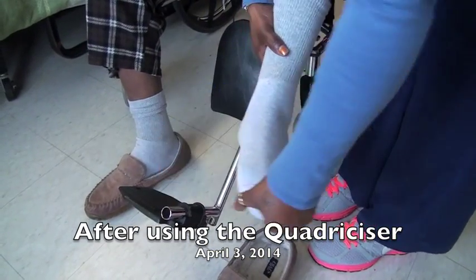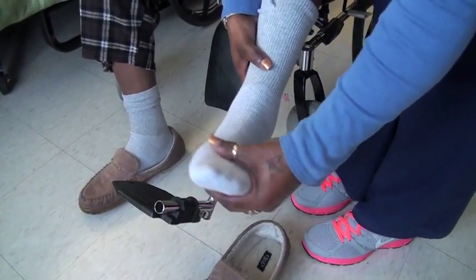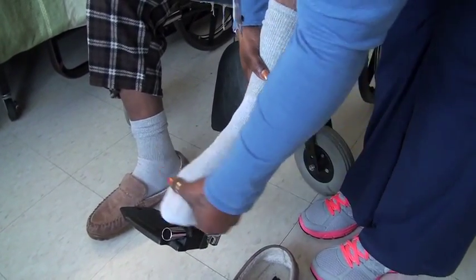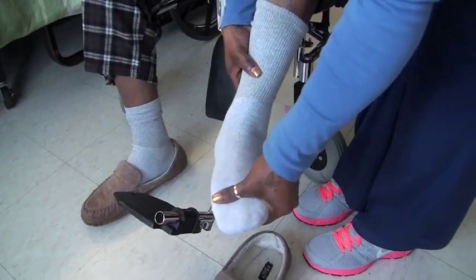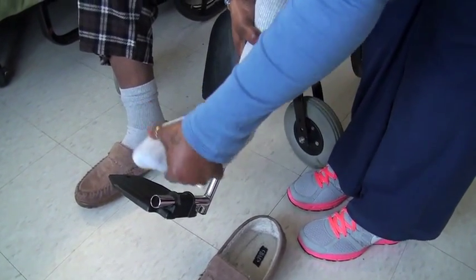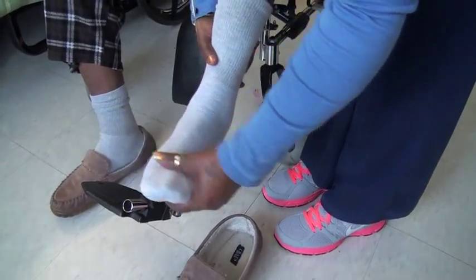Let's see. Does that hurt, Vane? Just the toe part — the toe part hurts a little bit. As for moving that ankle up and down, the ankle doesn't hurt? Just the toe part. The ankle is fine with this motion and range of it. Then that's the main one. The other one's okay. This is his stroke side.